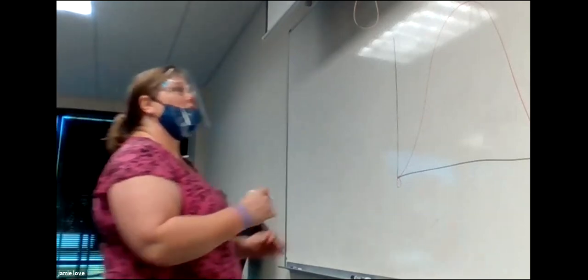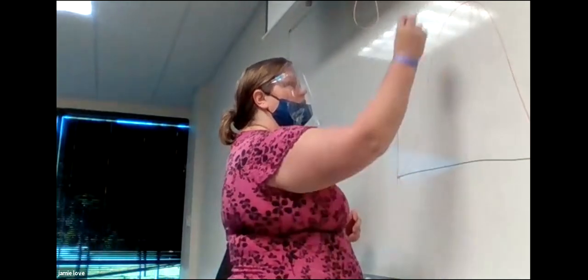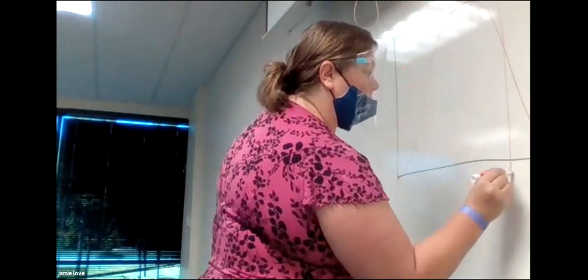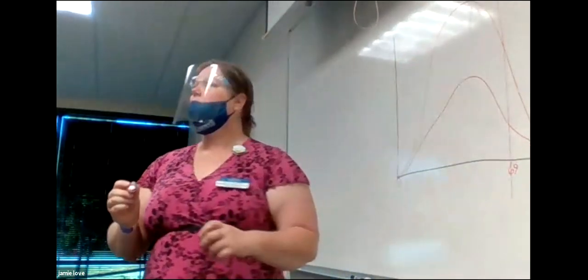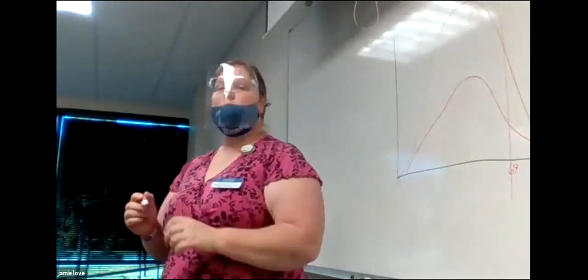Right. So we have this graph, mine's a little bit more of a bell than the one in the book, but this is considered the brems. And then there's a peak right around where that line is drawn. 69 is characteristics. So all of the rest of the spectrum is brems. So this line right here is where characteristics would be.